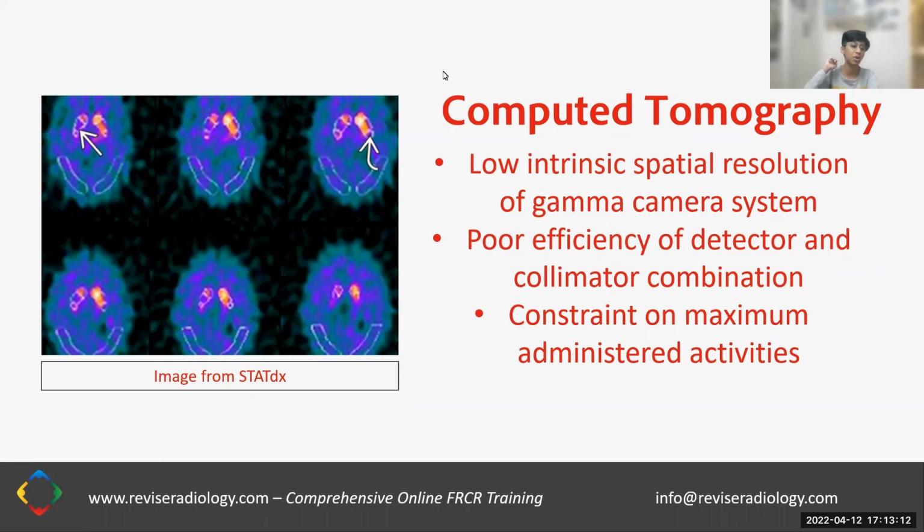Instead, what you're concerned about in this kind of imaging is the activity of the radionuclide which is being used, how long it's going to remain in the body, and how long the patient is going to be exposed to the radiation. Everything that the radionuclide comes in contact with acts as a further source of radiation. That's something which is important to keep in mind when we're talking about administering radiopharmaceuticals.